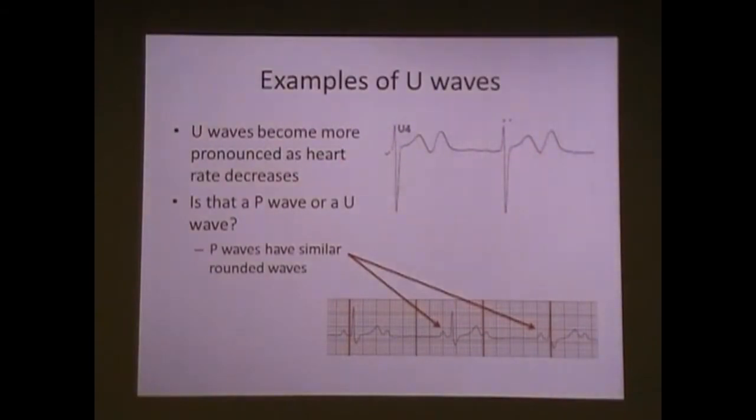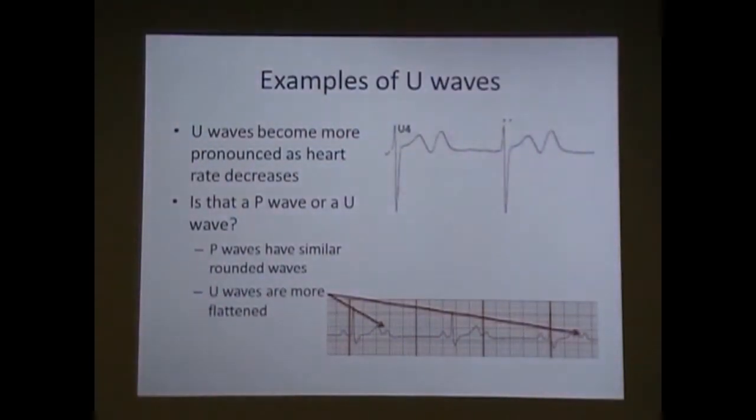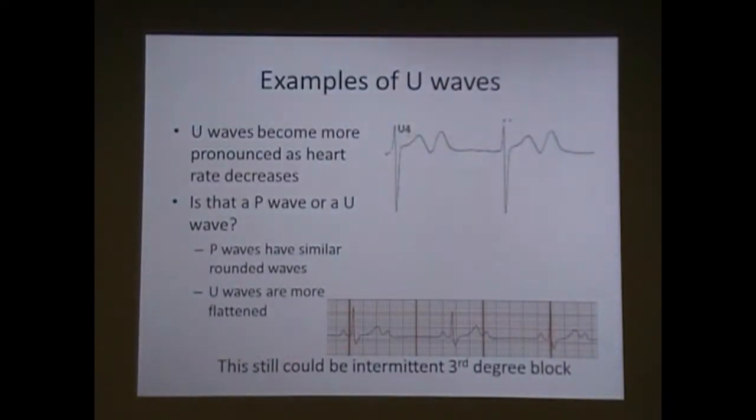But knowing about the U waves and thinking about it, to me, the U waves are a little more flattened on top. It still could be intermittent third degree. So the clinical picture is as important as the EKG to me.